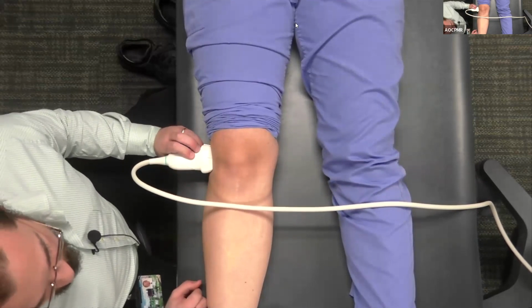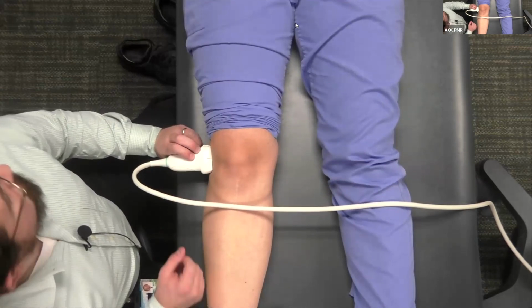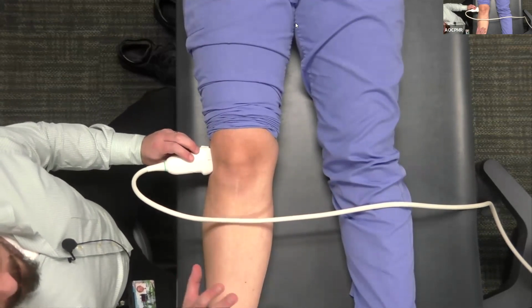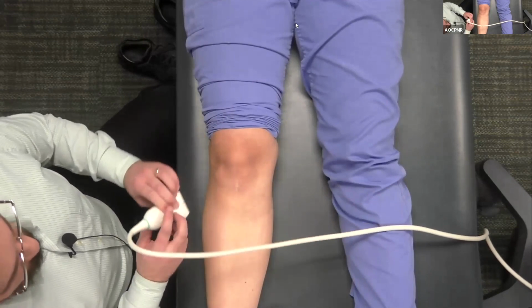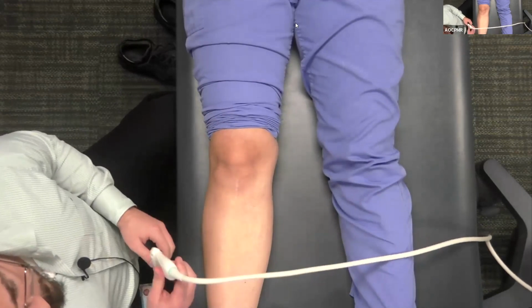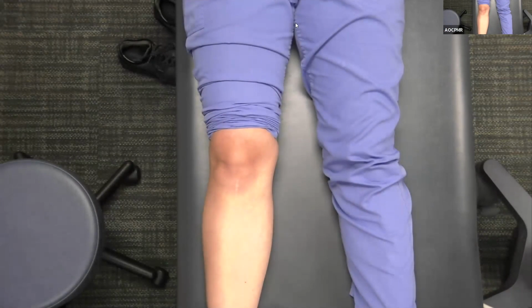You can have your patient in the supine position for all of this. If you're really trying to focus on an area, though, I recommend that you either have the patient lateral recumbent if you're looking at either side of the knee, or prone when we're going to do our posterior evaluation. But that's just for you guys to know. Moving on, you also want it at like 30 degrees flexion if you can.